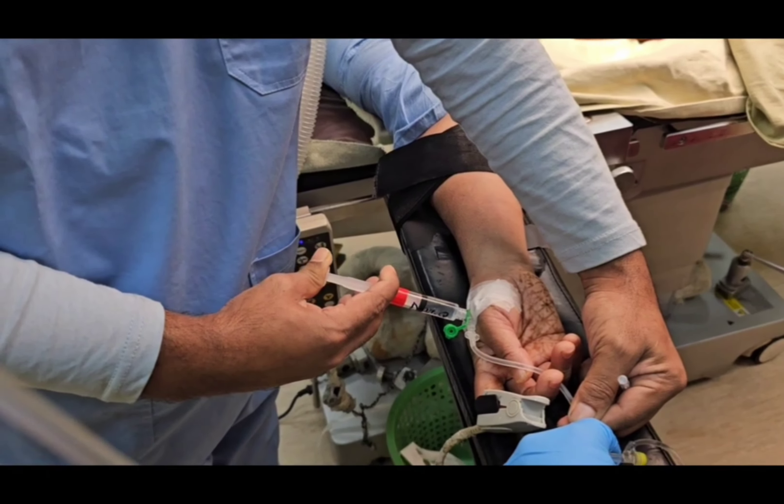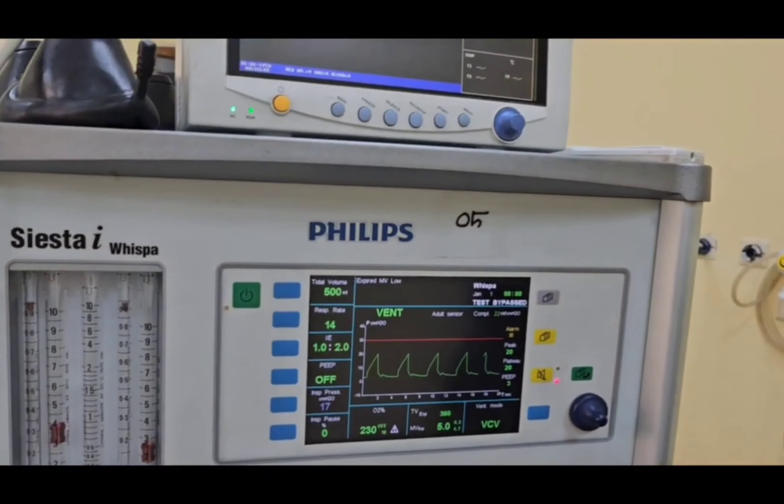Now the patient is ready for operation. Here we are explaining the five steps of general anesthesia in short: we did pre-oxygenation for five minutes with 100% oxygen; induction with fentanyl 2 micrograms per kg and propofol 2 mg per kg; intubation via video laryngoscope due to Mallampati grade 3; and maintenance with nitrous oxide, oxygen, isoflurane, and vecuronium — that is how the patient is maintained during the operation.